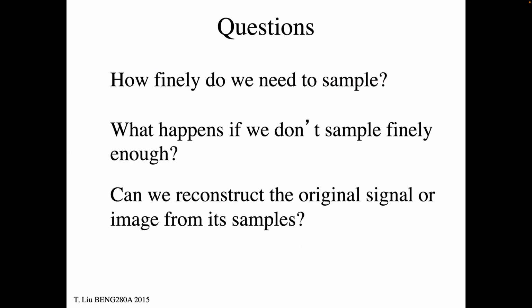So the big question is, if I want to take a picture of something and I want it to be an accurate picture, what sampling rate am I going to choose? If your sampling is too low, what are the artifacts that occur? Something to keep in mind is that a criterion for determining that your sampling rate is high enough would be that you can reconstruct the original continuous image from the sample points. So if I have an original continuous image and then I sample it, I have a discrete set of points over here. If just through interpolation and magic I can reconstruct the exact continuous image, then I'm sampled high enough.